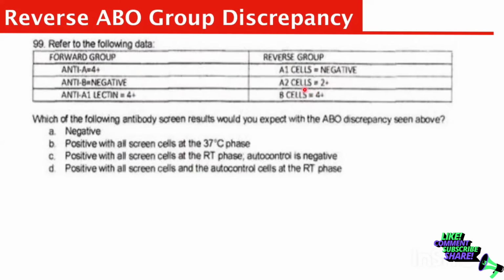I have said that this blood group A2 is less than 1%. They are not common. And even if they are expressed, it can be more sensitive at a lower temperature than 37 degrees, if that makes sense. So we don't know why this is here. Again, you can refer to the previous video that I mentioned in terms of following up on this one. There's a video that I made before this one.